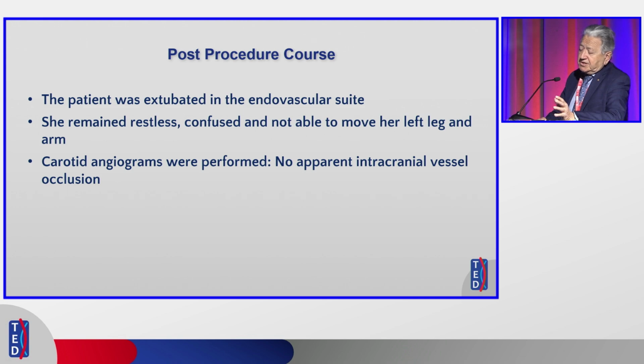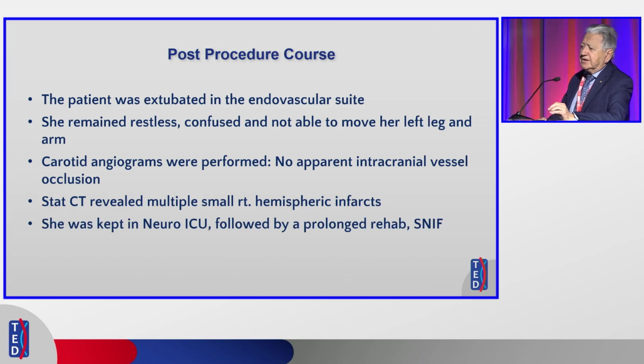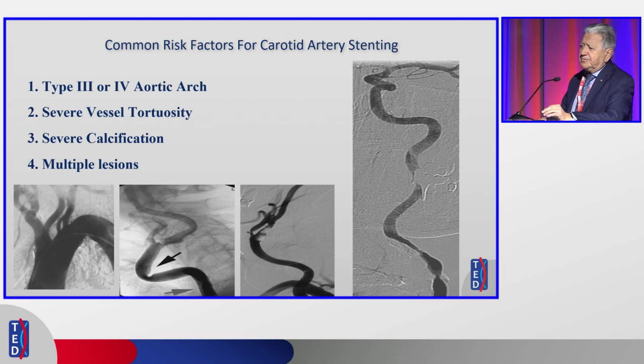As I showed, we didn't see anything on the angiogram, but a CT later showed multiple small right hemispheric infarcts. This was more than what you see on DWI, with any technology and techniques. She was in the neuro ICU, had prolonged rehab and finally ended up in a SNF.